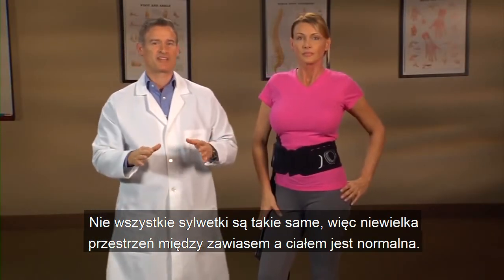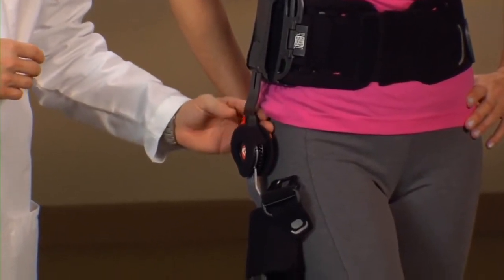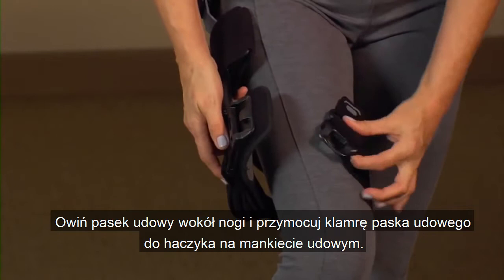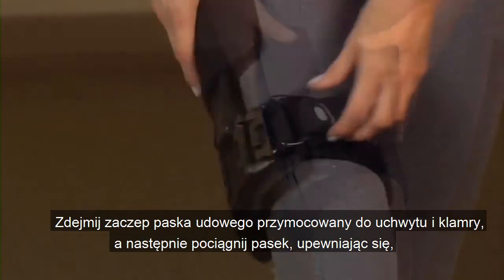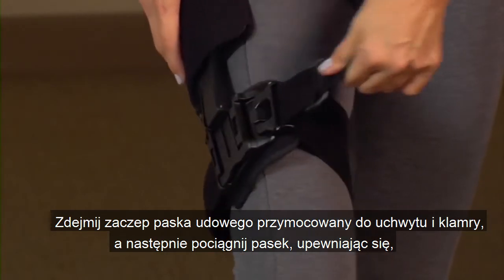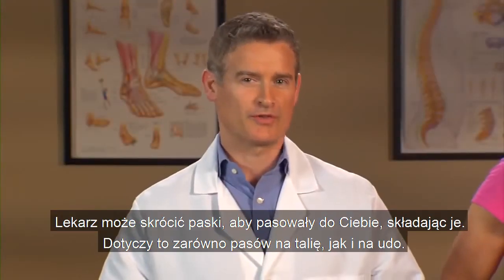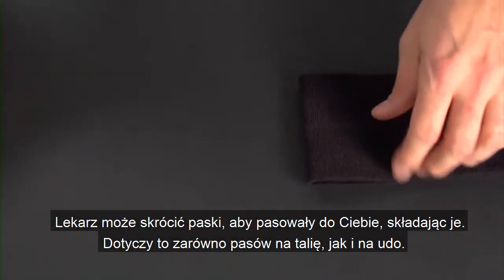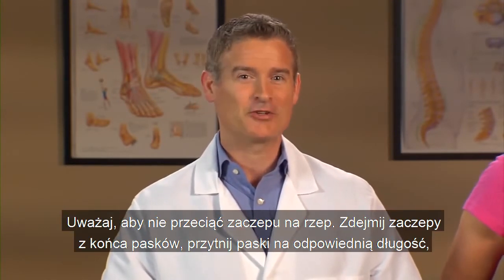Not all body shapes are the same, so a little space between the hinge and your body is normal. Wrap the thigh strap around your leg and attach the thigh strap buckle to the hook on the thigh cuff. Remove the thigh strap tab attached to the D-ring and buckle and pull the strap, making sure the thigh strap is snug at all points around your leg. Your doctor may have shortened the straps to fit you by folding them over. This includes both the waist belt straps and the thigh strap. You can continue to use the straps as folded or you can use scissors to cut the straps.